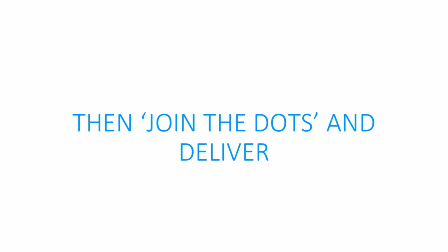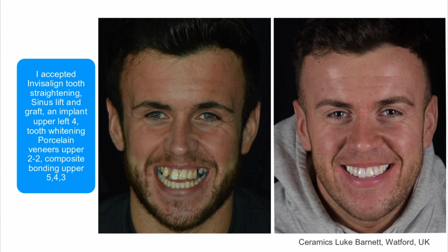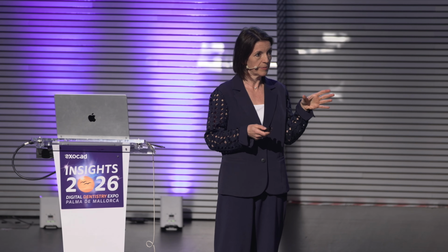So we can capture the patient, go through that treatment planning brainstorm, and then be able to tell the story in a visual way back to the patient, so that what he walked in asking for is only a portion of the treatment that he was able to accept and finance and go through all of the time in the dental chair that no patient wants to go through.